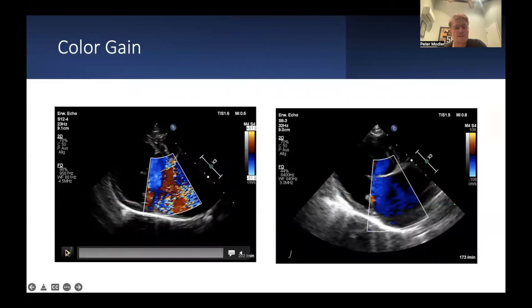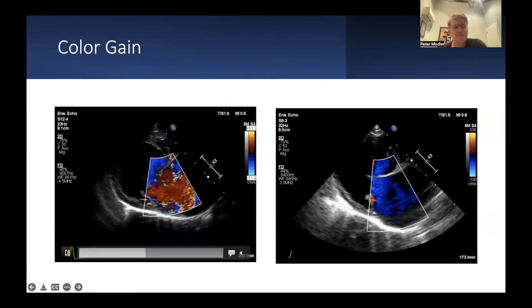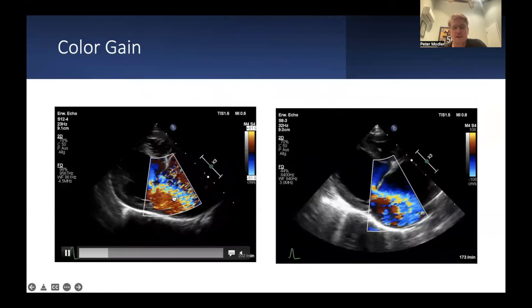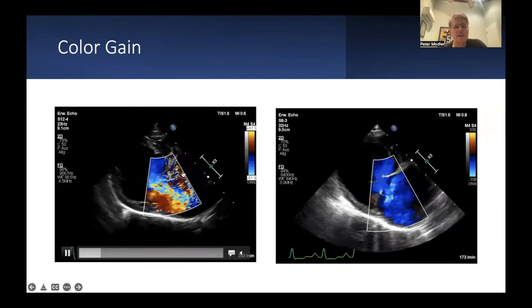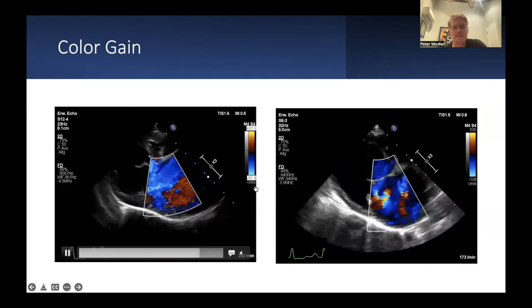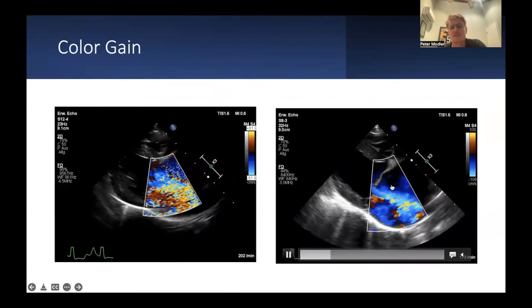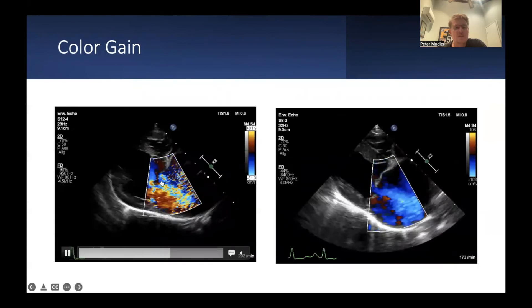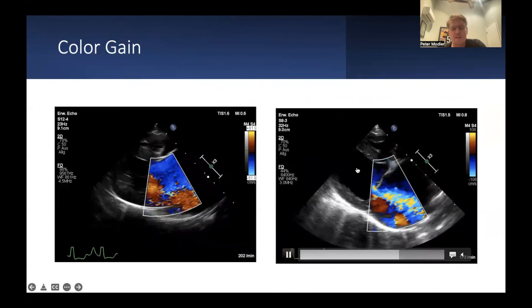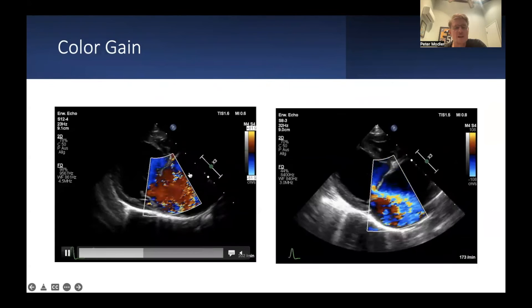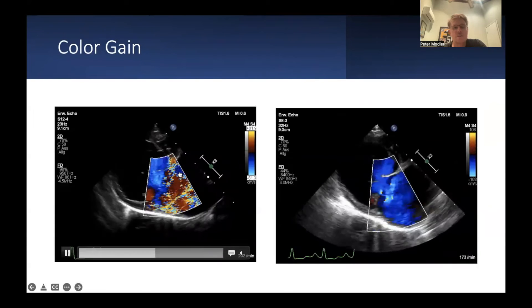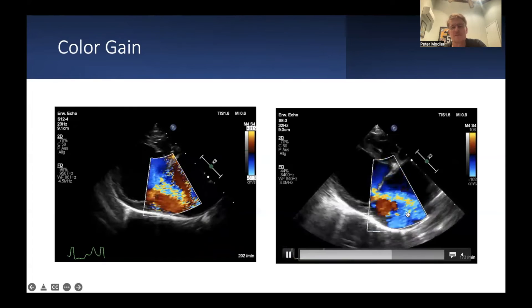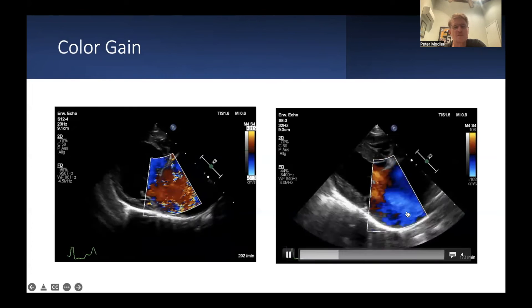What about color gain? On the left side and right side you see the same dog. On the left side I used a very high color gain setting; on the right side the settings are correct. What I did going from left to right was lower the color gain until there were no color speckles around the jet. This is something you simply have to try out by gradually reducing gain until you get a clean, clear jet.